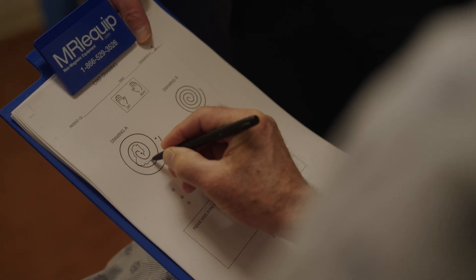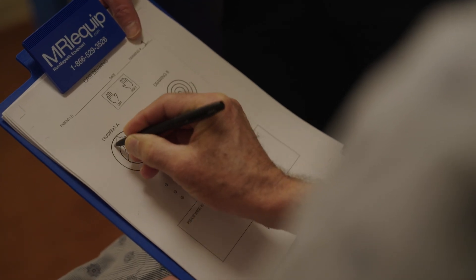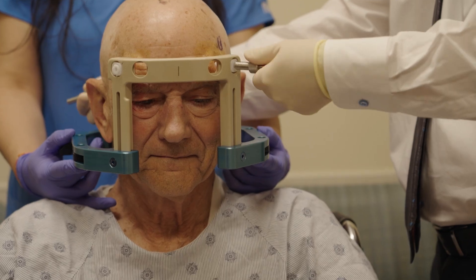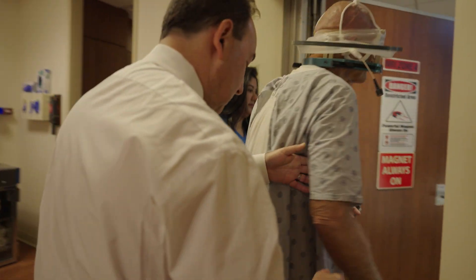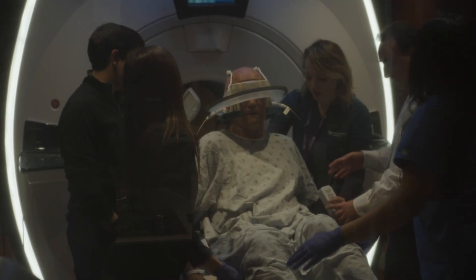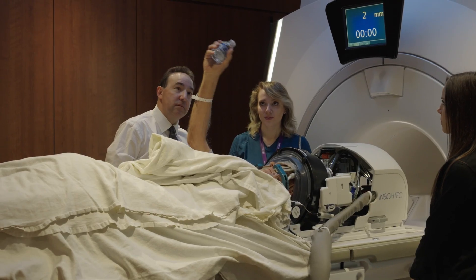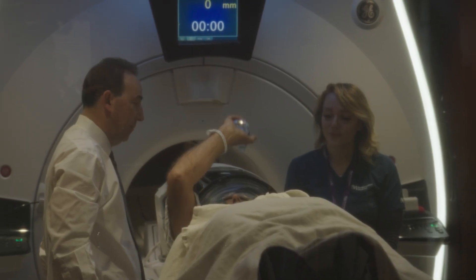MRI-guided focused ultrasound is an incisionless technique that allows us to create very precise focal lesions in the brain to treat tremor for patients who aren't great candidates for deep brain stimulation surgery or who would prefer not to have an implanted device. It allows patients to have immediate tremor relief without repeated visits for device programming, without concerns of wound healing, and without delays in achieving that relief.